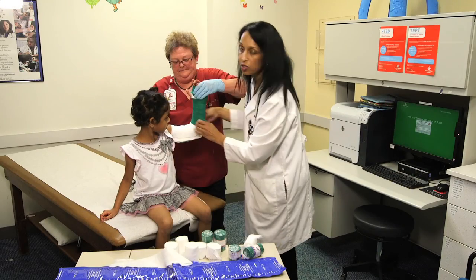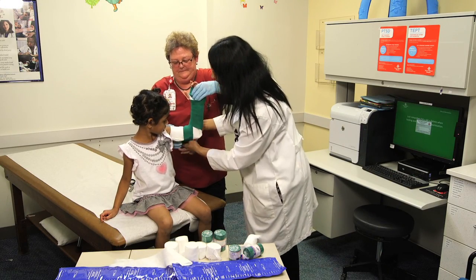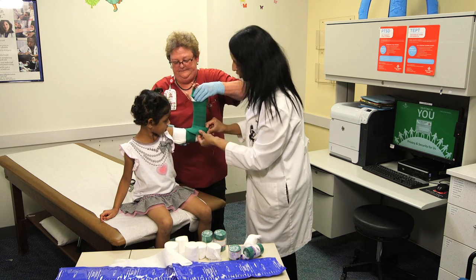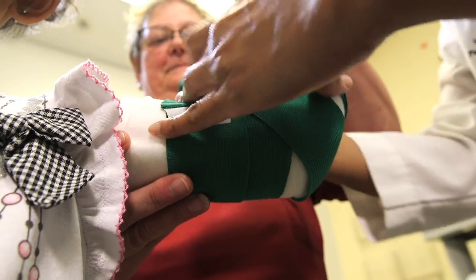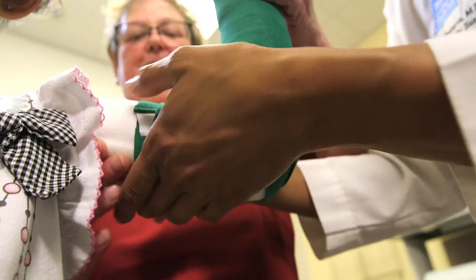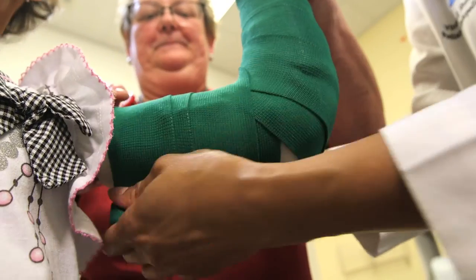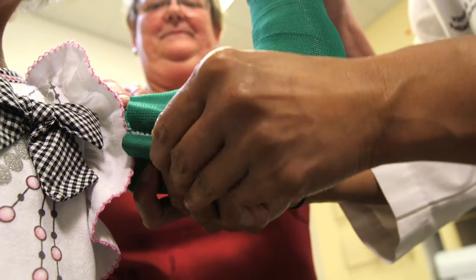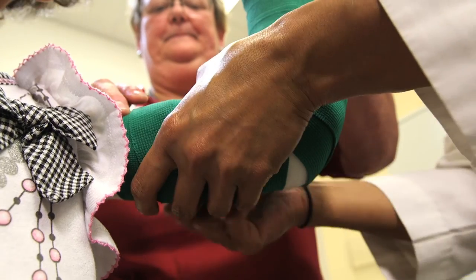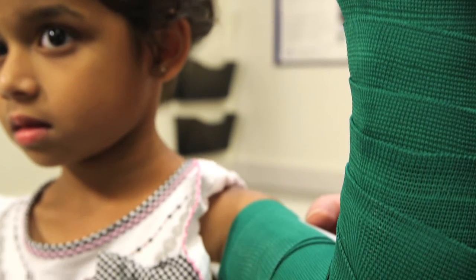This usually sets and hardens within about five minutes after getting wet. During that time, you want the patient to hold still because you don't want the splinting material to crack. If someone has an obvious deformity, it's best to send them to the ER for evaluation, as those children might need sedation or a reduction. For a minor injury where x-rays show minimal displacement, this is a very appropriate way to treat the patient until they can be seen by an orthopedic surgeon within a few days.